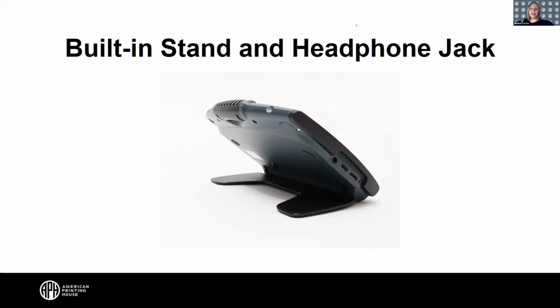Not really, just that it has the stands. I think we'll go over the ports on another slide. But yeah, it just has a stand that you can deploy, and you can pull the stand out and have it flat on your reading material and use it that way, or you can collapse the stand and close the stand and hold the Juno above what you're reading as well.